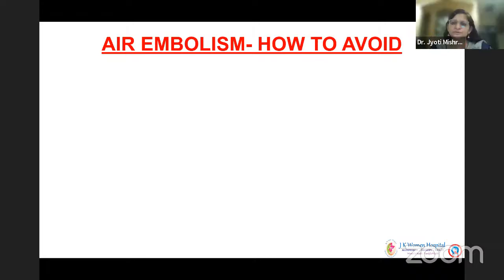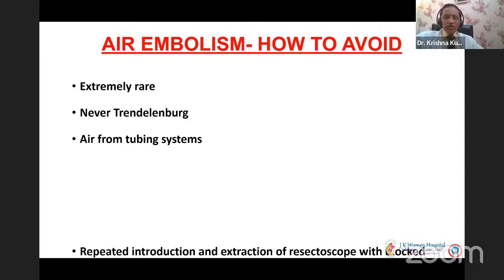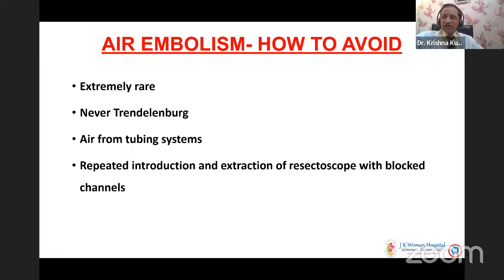No Trendelenburg, like in conventional laparoscopy. Never use Trendelenburg. Then purging of the tubes, removing air from the tubing systems. Repeated introduction, as Soumil said, these are three common factors which you should avoid and take care of. Then air embolism will almost never be possible.